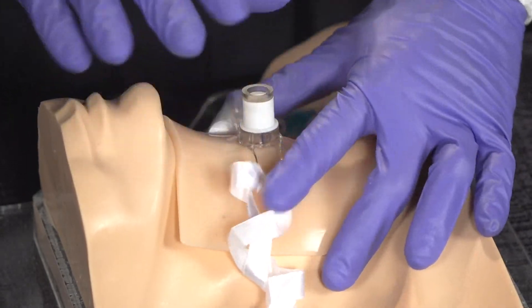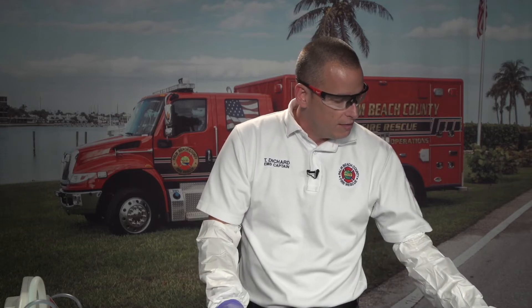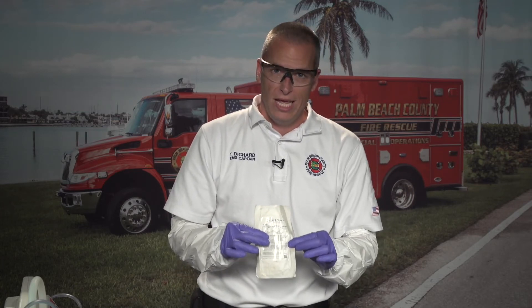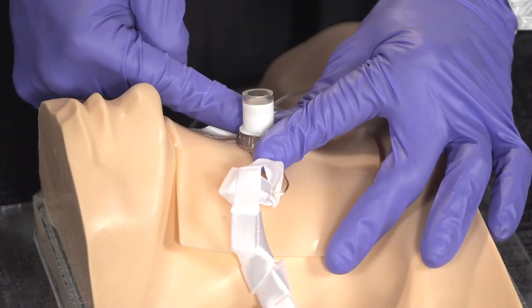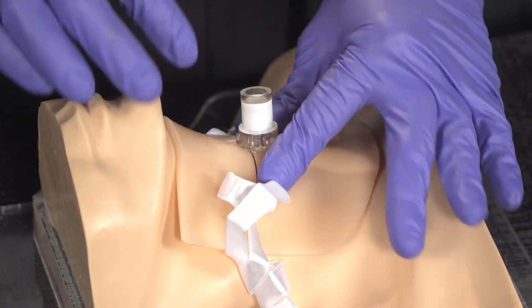For a pediatric patient, the equipment is slightly different. You would perform a needle cricothyrotomy using the Quick Fix Junior kit. Inside that kit is a 14-gauge needle, which is inserted in a downward direction at the exact same hill-valley-hill location through the cricothyroid membrane. You then ventilate the patient through the 14-gauge needle. This is for pediatric patients 12 years old and younger.